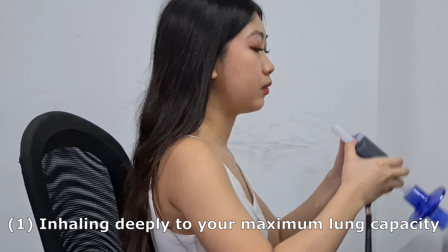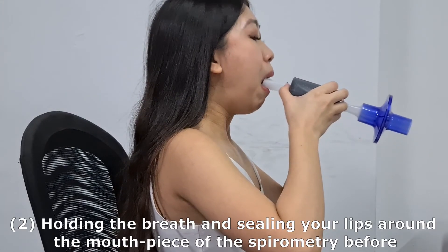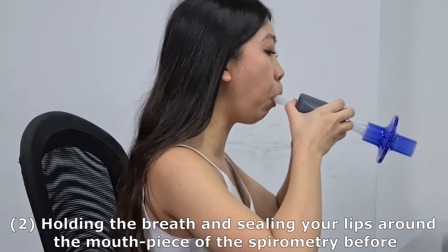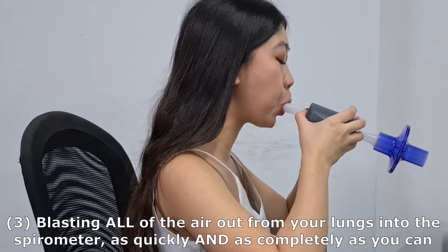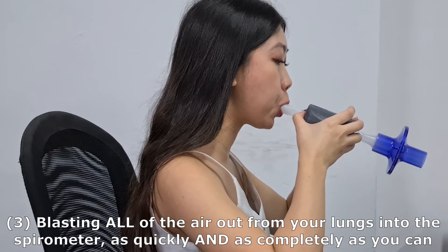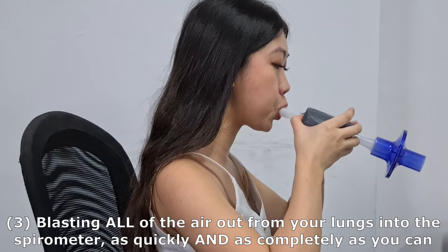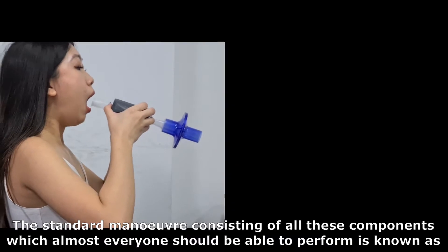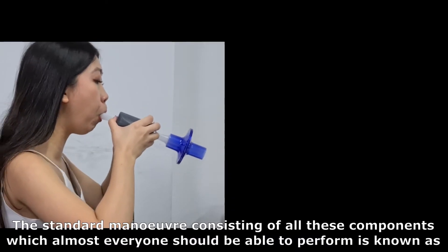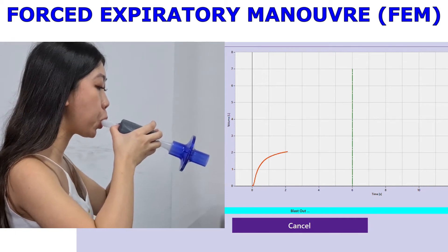1. Inhaling deeply to your maximum lung capacity. 2. Holding the breath and sealing your lips around the mouthpiece of the spirometer. 3. Blasting all the air out from your lungs into the spirometer as quickly and as completely as you can. The standard manoeuvre consisting of all these components, which almost everyone should be able to perform, is known as the forced expiratory manoeuvre, or FEM.